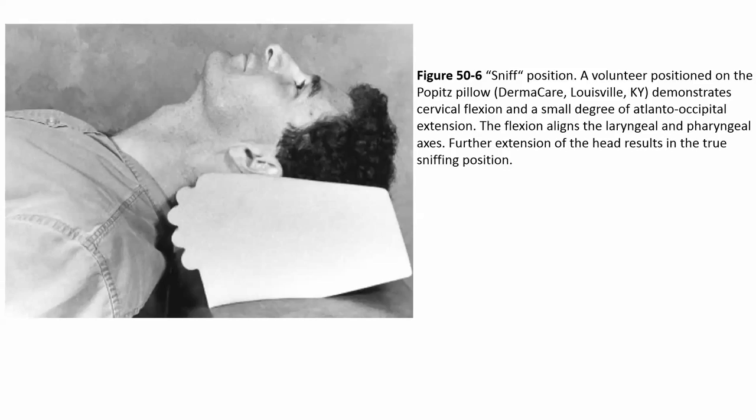And as indicated in the legend, the pillow demonstrated on this slide does flex the cervical spine and creates a certain amount of atlanto-occipital extension. The theory behind this is that it aligns your laryngeal and pharyngeal axes. And if nothing else, it helps lift the patient's head off the pillow, and some patients have quite heavy heads.